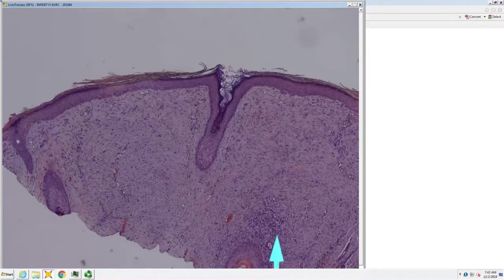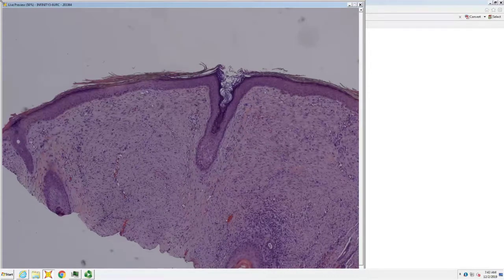There are lymphoid aggregates. You would definitely want to stain it with something like a P63 or high molecular weight keratin for squame. Something for desmin. We don't use smooth muscle actin because it's too sensitive. A third to a half of AFX has smooth muscle actin. It's been said all God's children have smooth muscle actin to some extent.